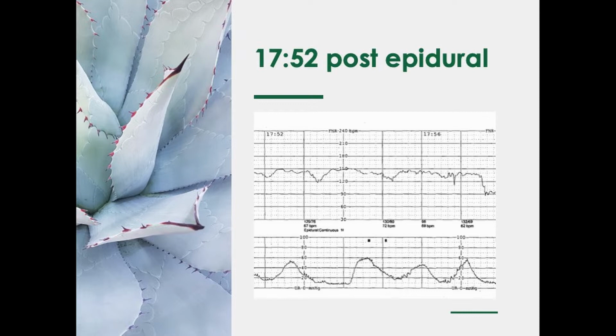Following an epidural, what kind of decelerations do you see here? I'm hearing lots of variables. Okay, so what's the definition of a variable fetal heart rate deceleration? Everybody's saying words and they're all different.